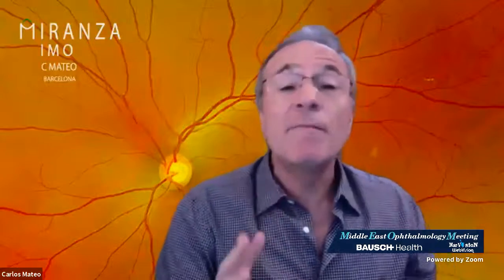I don't know if they rotate with the movements of the eye, but perhaps it's the iris dynamics. The iris moves and affects those lenses. Usually with those patients we need them to dilate, so we try to dilate, and that also has an effect, along with the atrophic part of the iris at the site of the suture. But of the 3 of them, only 1 suture failed, only one lens.